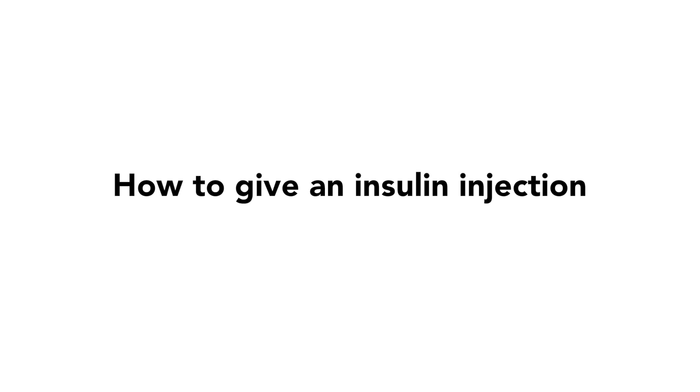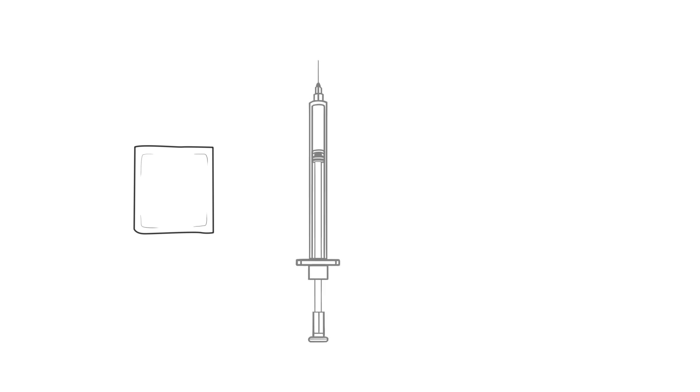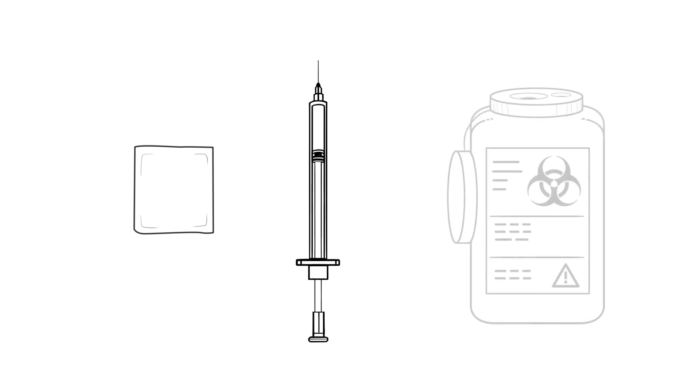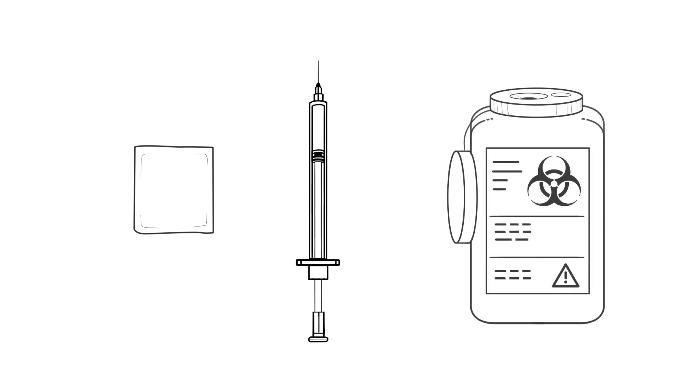Next, let's see how to give an insulin injection. Here is what you need: one alcohol pad, one syringe filled with the right amount of the right insulin, and one container to throw out sharps.